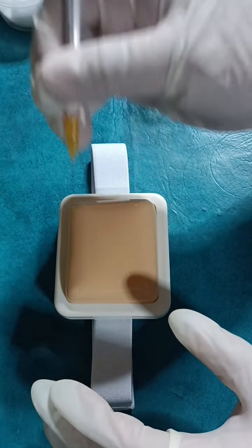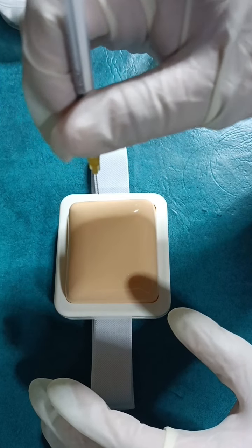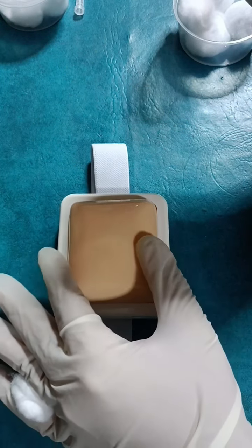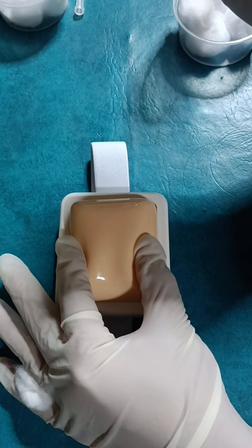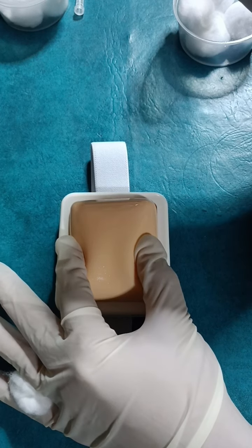So it's either a 45 or 90-degree angle before injecting. Using the non-dominant hand, pinch or spread the skin where you insert the needle, and push firmly and steadily.